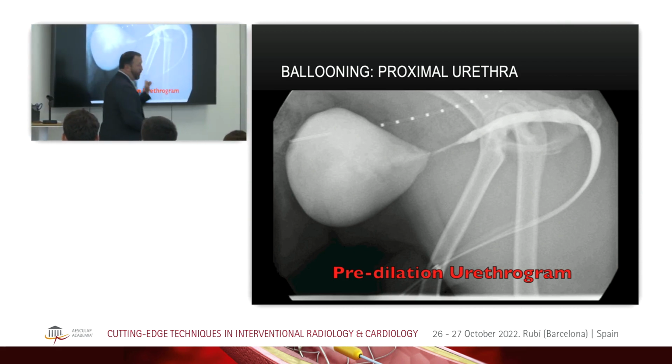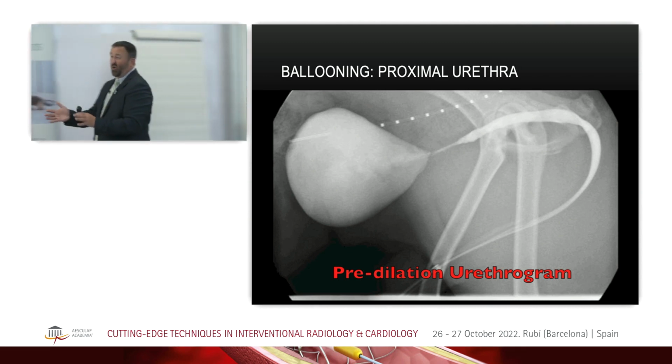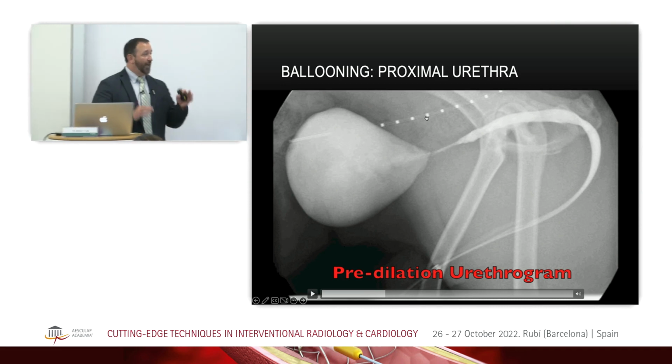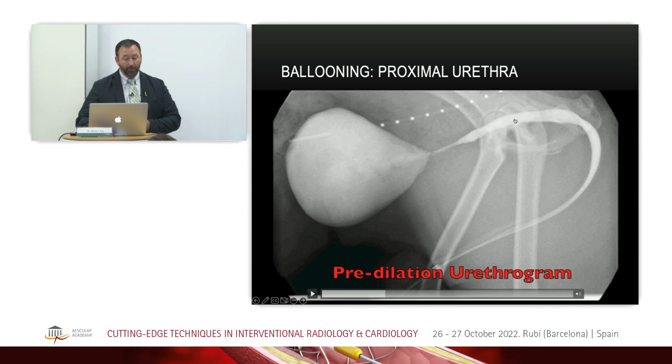The distance between the front of one box and the next is 1 centimeter. It's not always the case, so look on the packaging, but for this particular marker catheter, if you measure from here to here, it's 1 centimeter. So I can calibrate that to know how wide the diameter of the normal urethra is here.